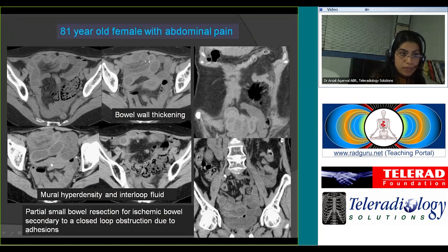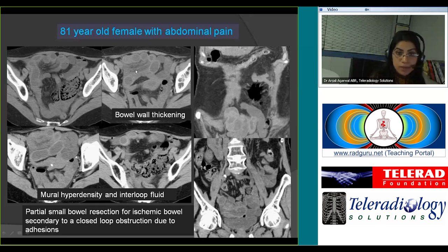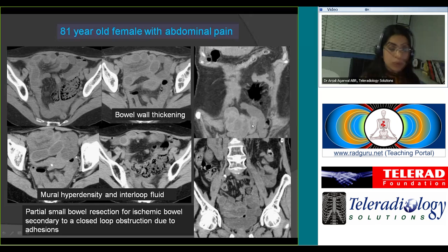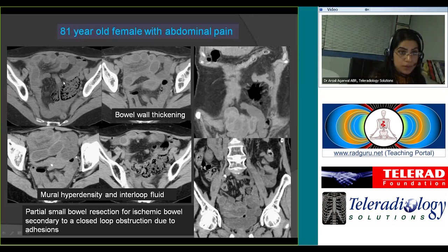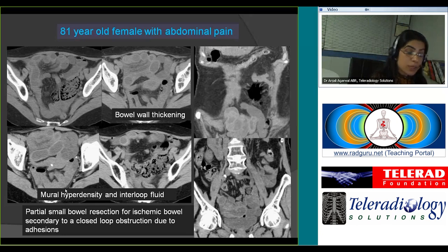Other signs of bowel ischemia in bowel obstruction: bowel wall thickening, hyperdense bowel wall indicating hemorrhage within the wall secondary to ischemia, inter-loop fluid, and fluid in the mesentery. This patient had closed-loop obstruction secondary to adhesions and had to undergo partial small bowel resection. When there is closed-loop obstruction with signs of secondary ischemia or strangulation, the patient needs operative management — unlike a simple uncomplicated bowel obstruction where non-surgical management may work.